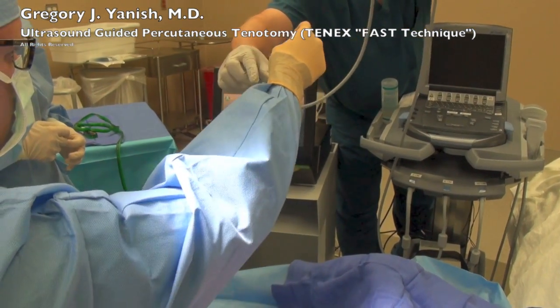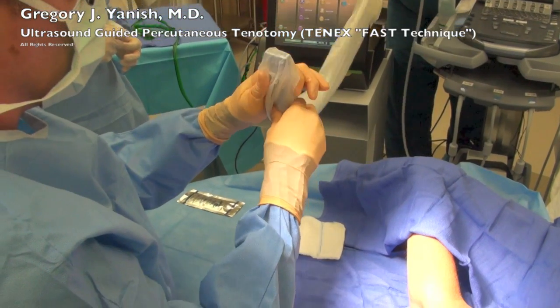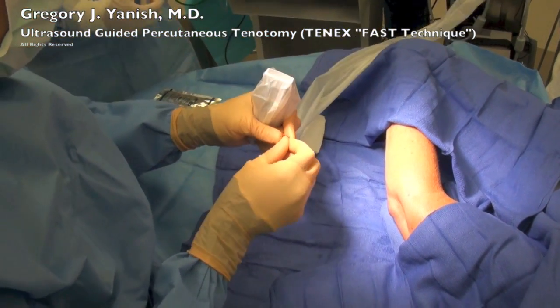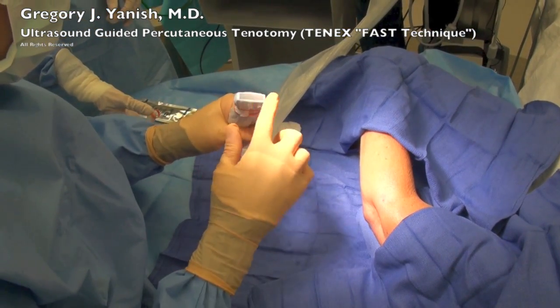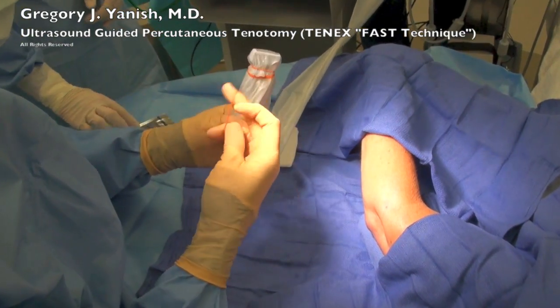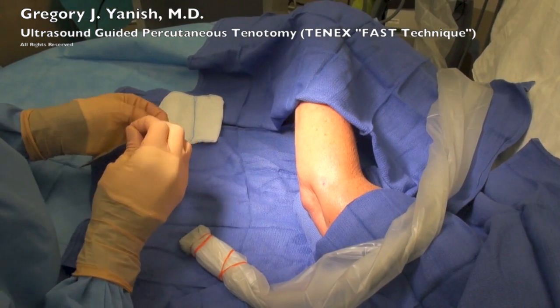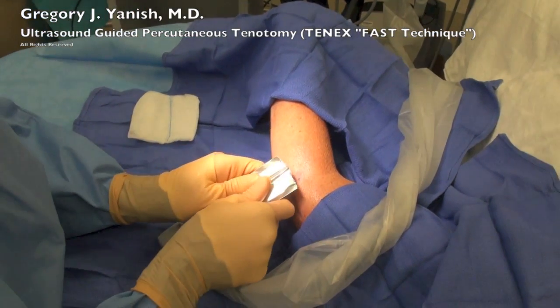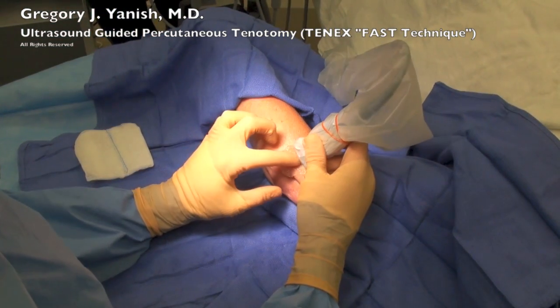We'll start by wrapping an ultrasound probe with a sterile cover. This allows us to maintain sterility through the entire case, as well as continue to visualize everything with ultrasound. I then use some sterile ultrasound jelly, which actually feels cold to the patient. This particular patient is awake during this procedure and will only be under local anesthetic.